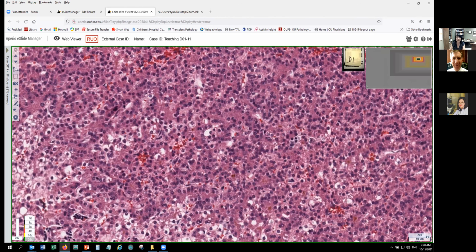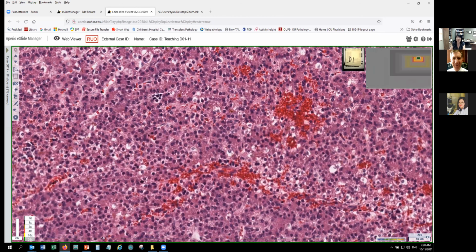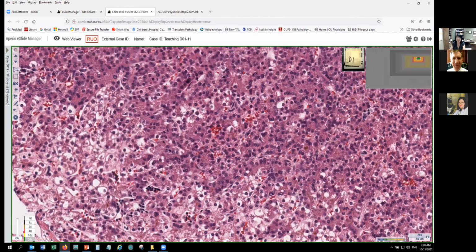The pink epithelial cells are arranged in cords, mimicking liver cells. The cells are well differentiated, mimicking normal fetal hepatocytes. Look at this whole area, then we go to the light area.